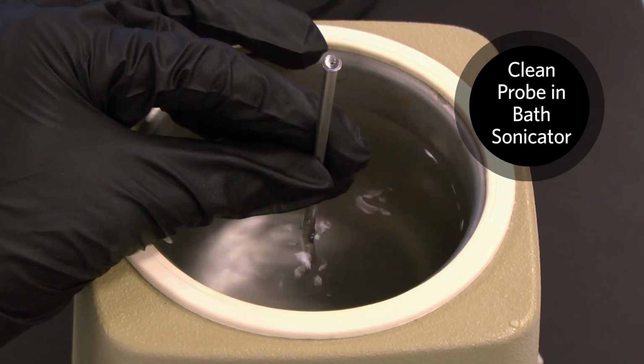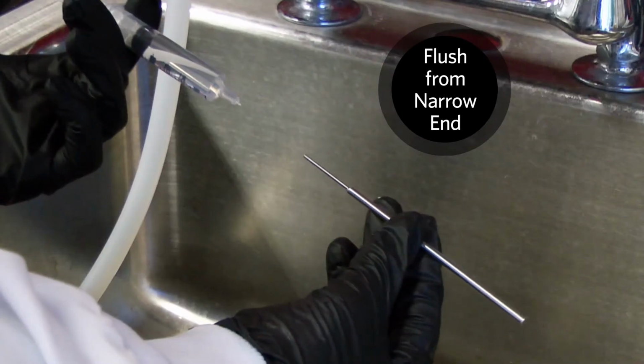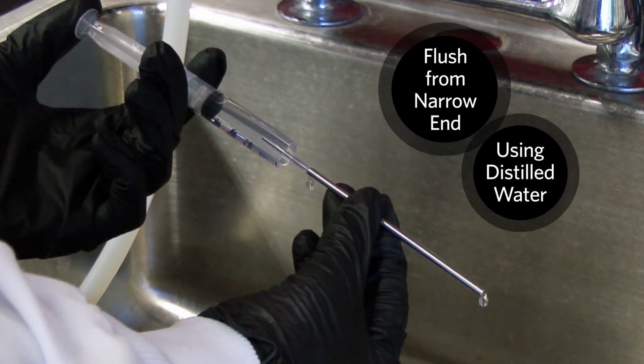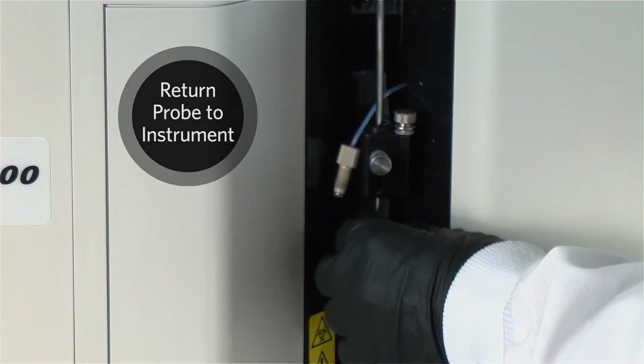To clean the sample probe, sonicate the probe in a bath sonicator. Then flush the probe using distilled water and a syringe. Flush from the narrow end out through the larger end. Return the probe to the instrument.